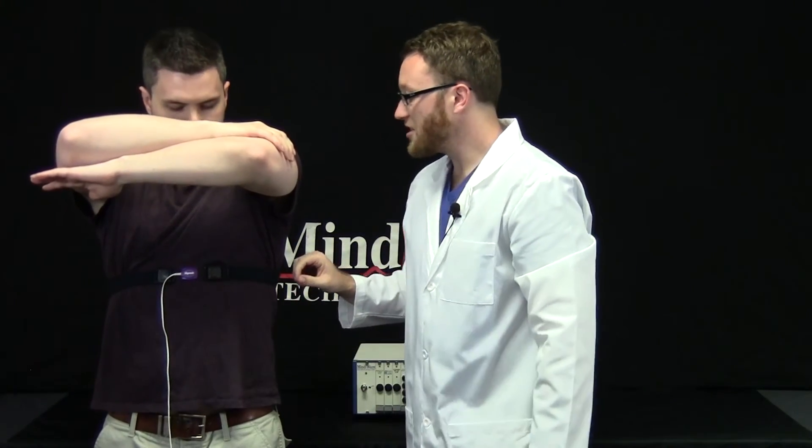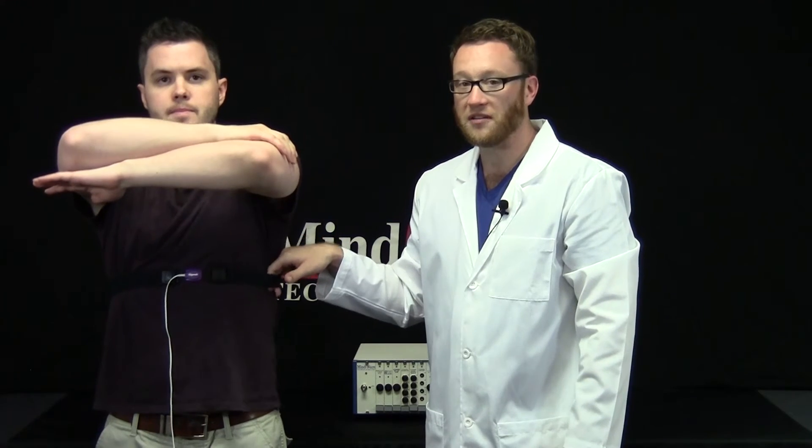The belt should be just snug enough that you can fit two fingers between it and the subject. And if the subject is wearing impedance cardiography leads, be sure that the belt is not putting tension on the lead wires.